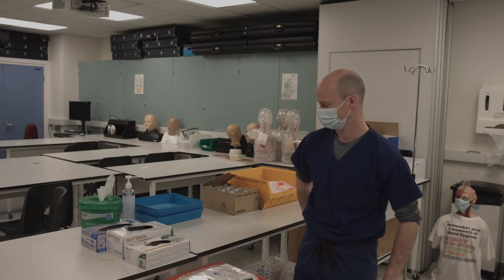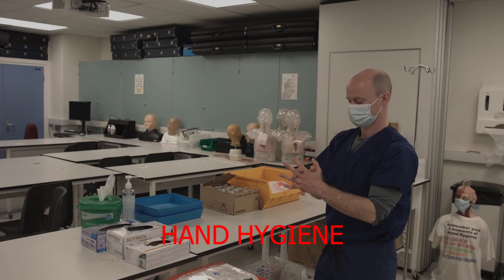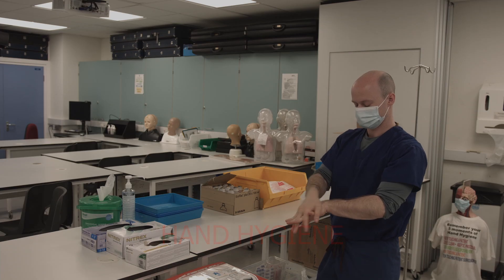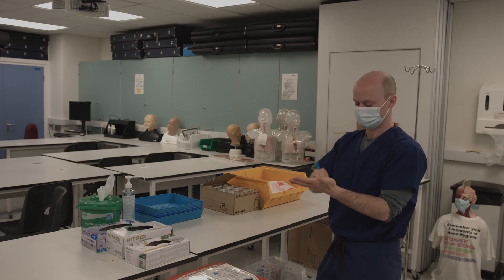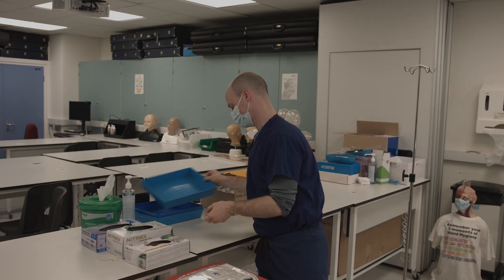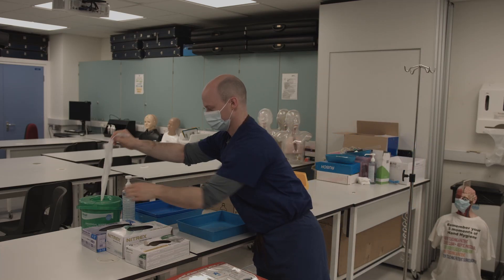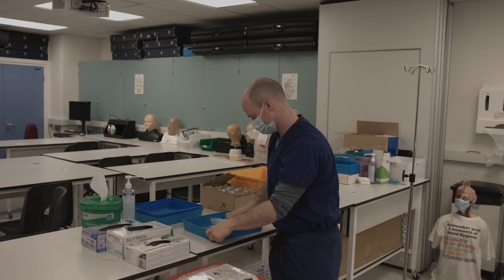In this video, we will be showing you the entire blood transfusion station in real time. We will be using a cannula to take the bloods. Begin by cleaning your hands thoroughly. Once done, you can collect your tray and clean with a clonell wipe, starting from the inside and working outwards.